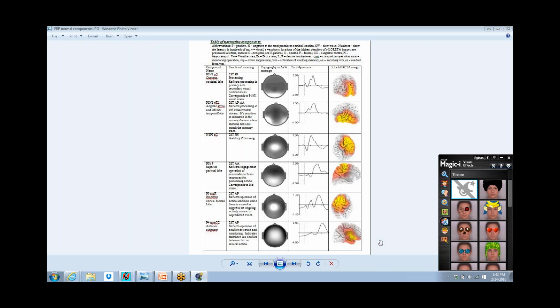The brain has compensatory mechanisms. SMR frequencies, beta frequencies, they're very commonly used to compensate for another issue. And as such, if you see an outlier, you need to figure out, is this SMR a stabilizing rhythm that's trying to put the lid on the boiling pot here? There's too much of it, but is it a good thing or a bad thing? We just know that there's too much. I wonder what extremely gifted individuals in different ways might look like comparing to statistical tables. 3 options: abnormal, compensatory, or a unique outlier state.